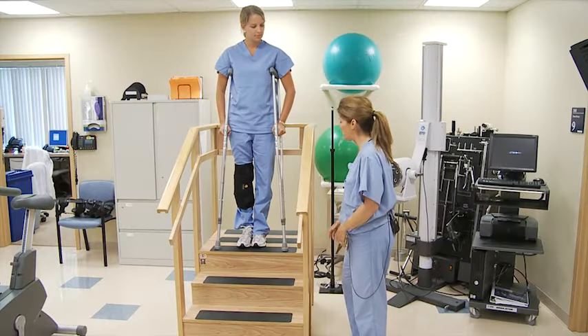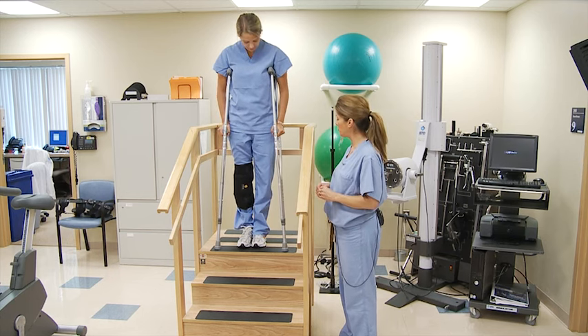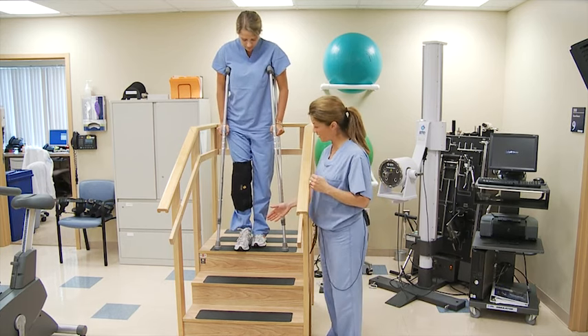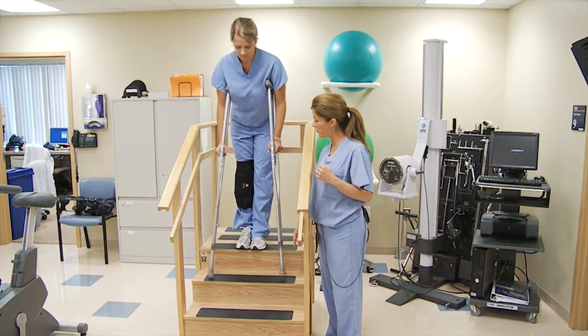Sarah, now we're going to teach the sequence of going down the stairs with crutches. You're going to be told your weight-bearing status, and you will follow that as prescribed. So you're going to bring your toes to the edge of the stair, and you're going to bring the crutches down to the lowest stair before.